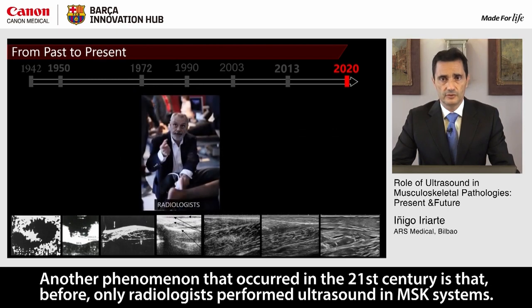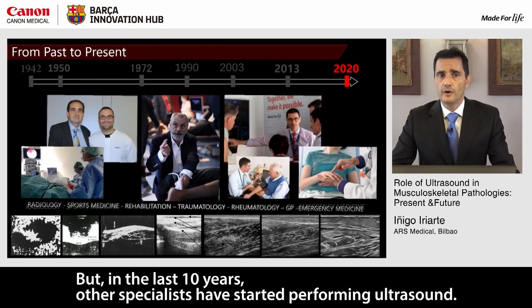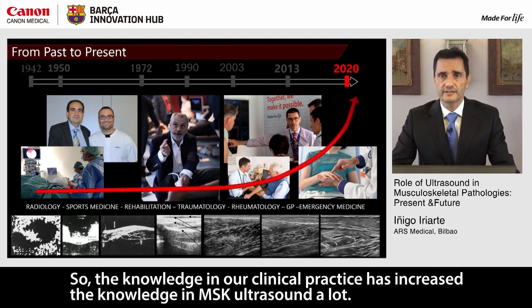Another phenomenon that occurred in the 21st century is that before, only radiologists performed ultrasound in the MSK system, but in the last 10 years other specialists have started performing ultrasound: sports physicians, rehabilitation specialists, traumatologists, rheumatologists, general practitioners, and others. So the knowledge of MSK ultrasound in our clinical practice has increased a lot.